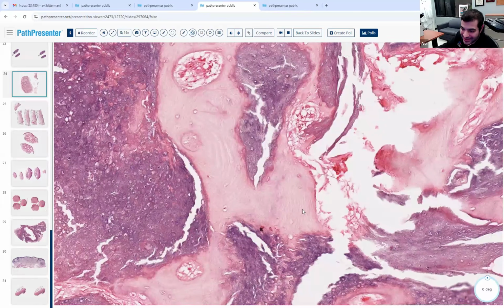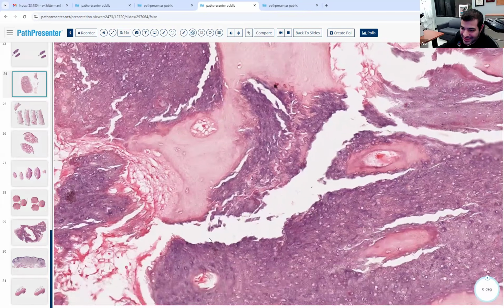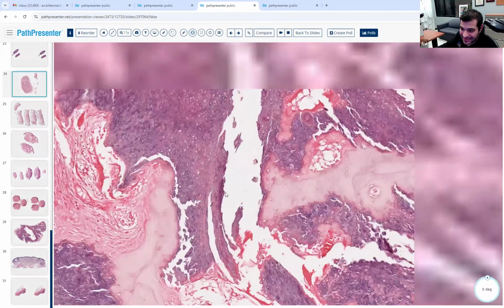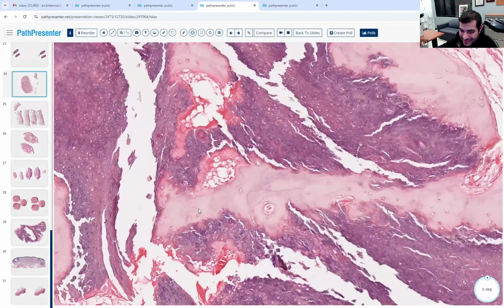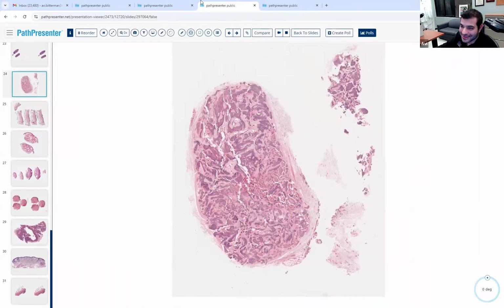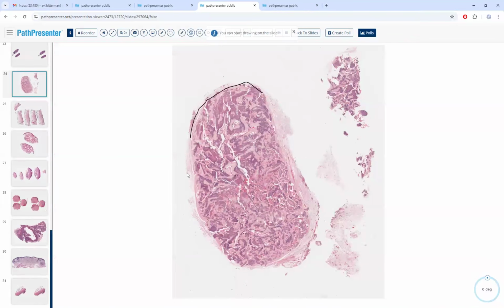It's more organized as well. Doesn't look like there are chondrocytes here, or chondroblasts. But let's take a step back. All right, guys. Benign or malignant? Benign. Quite benign. Yeah. Okay, right, this thing shelled out.